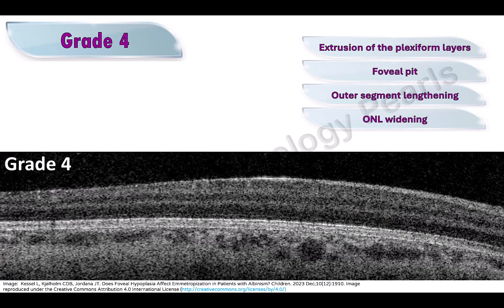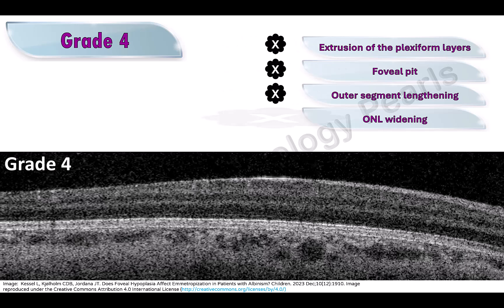In grade 4 foveal hypoplasia, in addition to the features of grade 3, outer nuclear layer widening is also absent.